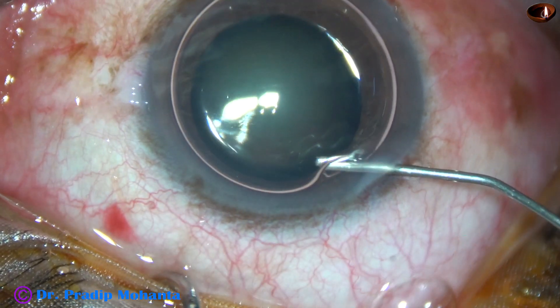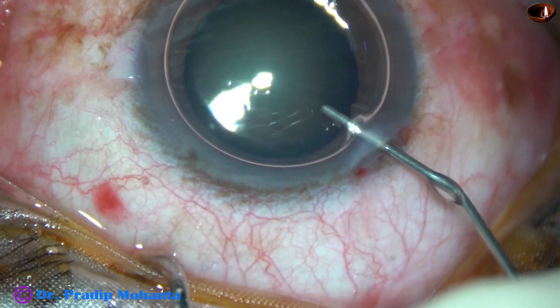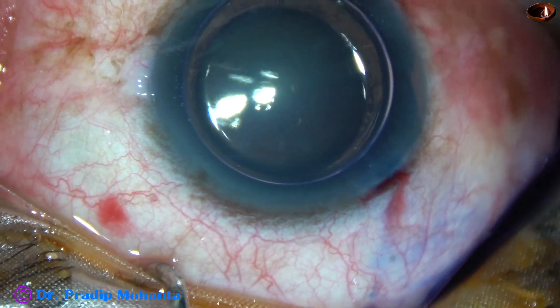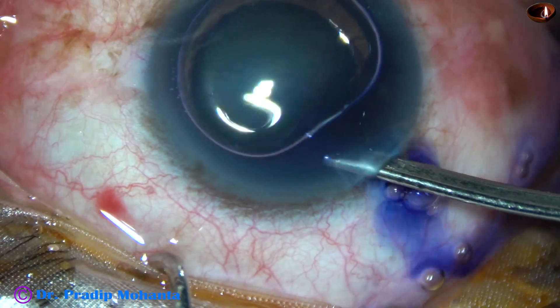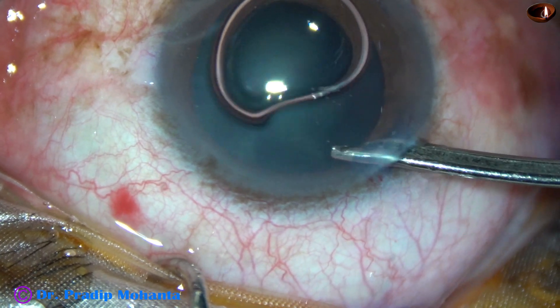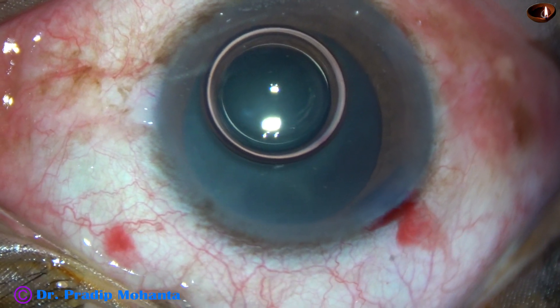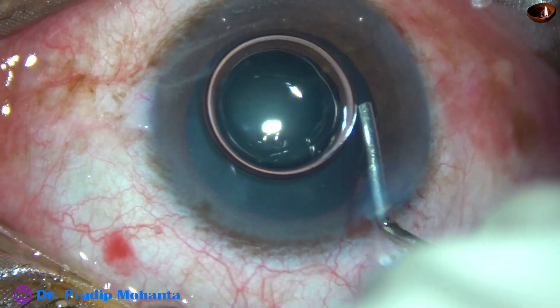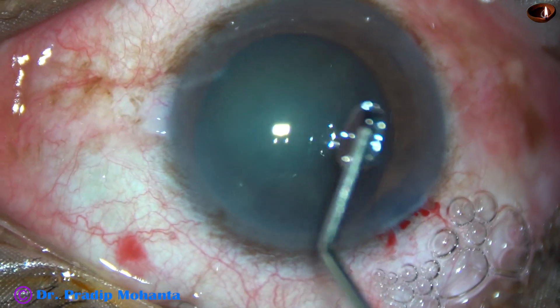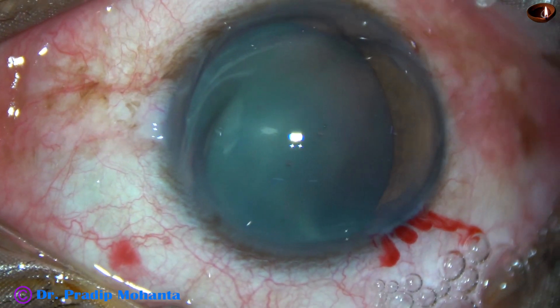Underneath this air bubble, trypan blue dye is applied over the anterior capsule. The dye is then washed out with BSS using a 23G Simcoe cannula. The anterior chamber is then filled with 2% hydroxypropyl methylcellulose. The methylcellulose is applied over the corneal epithelium for better visibility.